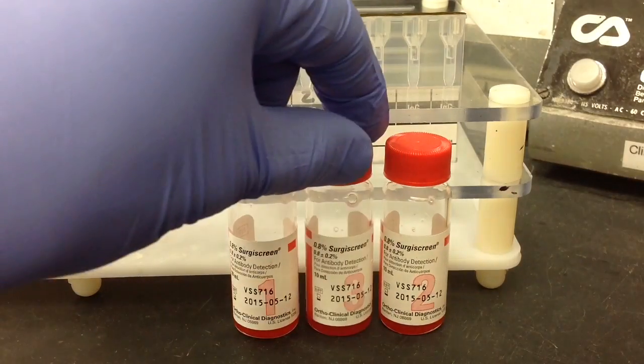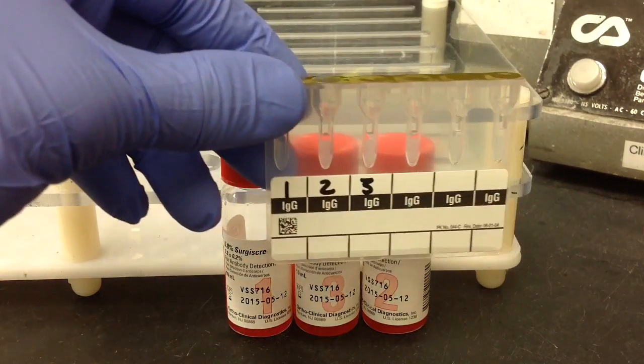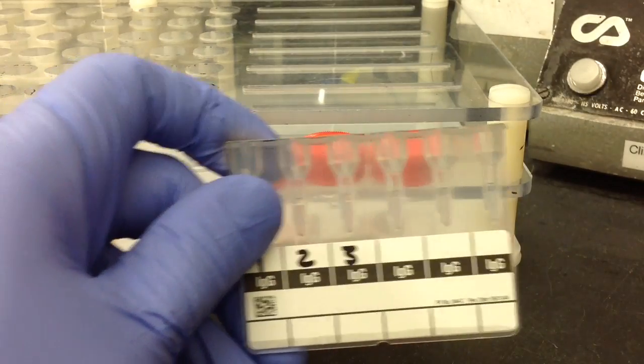First thing you need to get together is your reagent red cells and you're also going to need to get a gel card. I've already labeled mine for the corresponding reagent red cells.